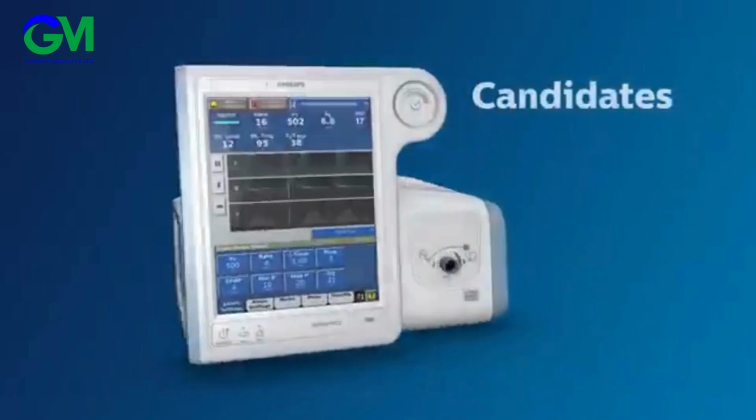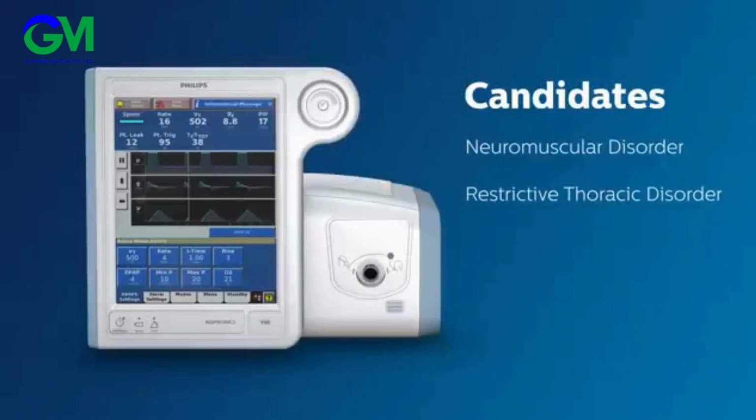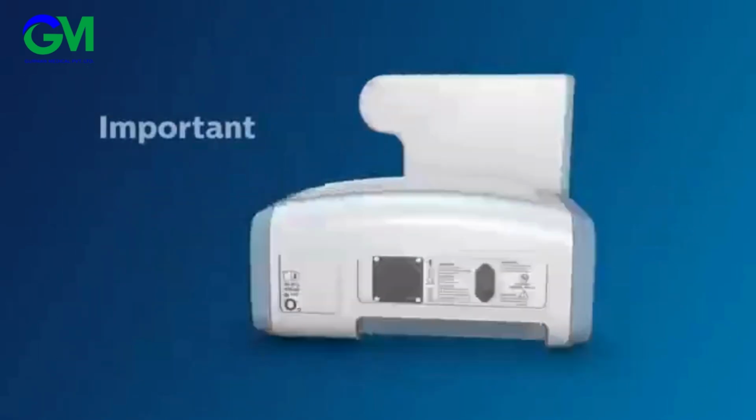So, which patients can benefit from AVAPS? It's for those non-acute patients who may not otherwise achieve sufficient tidal volume on their own. For example, patients with neuromuscular disorders, restrictive disorders, and obesity hypoventilation syndrome. They may not need frequent IPAP changes, but if they do need a changing IPAP in small increments, they will benefit from AVAPS.